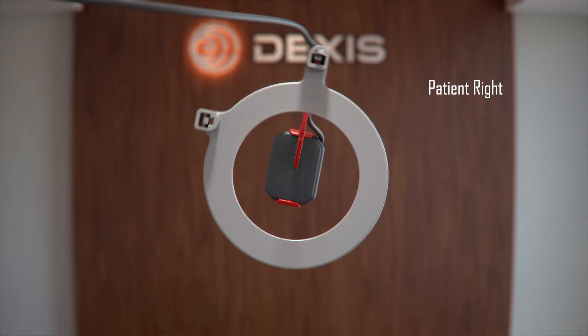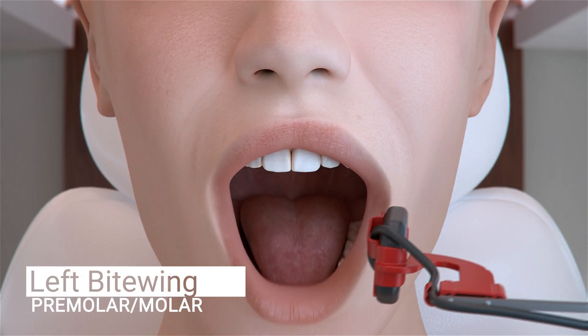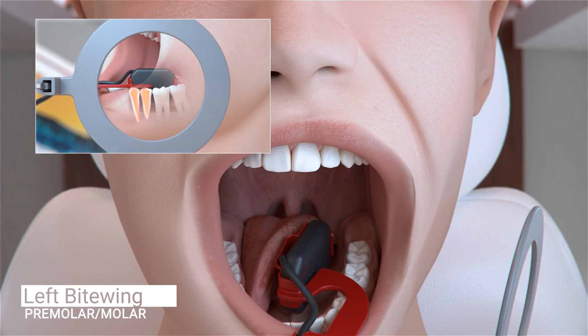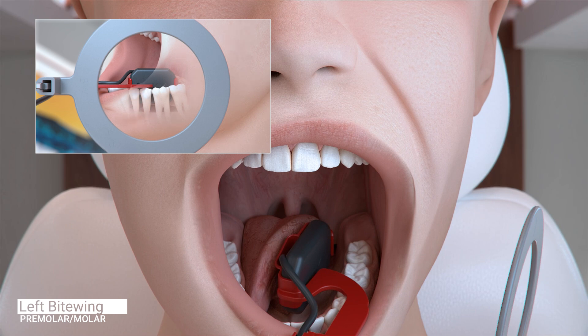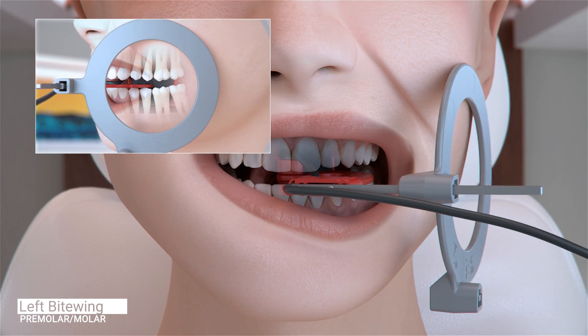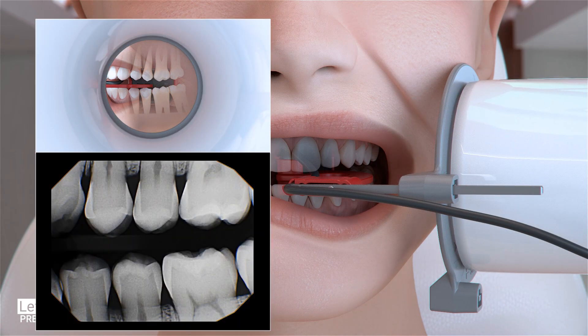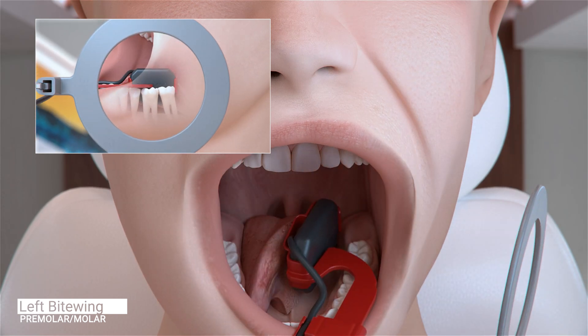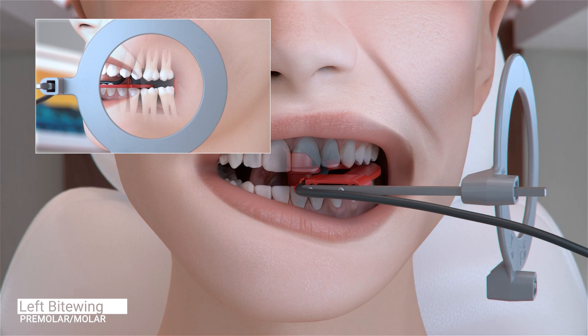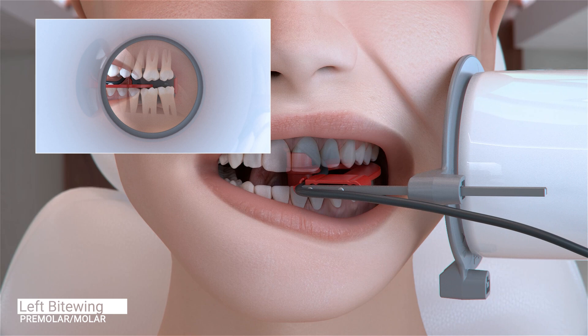The configuration of the sensor and holder does not change for the next and final set of images, the left bite wings. Ask the patient to open slightly and center the first and second premolar on the sensor. Move the sensor toward the midline and slightly forward again to capture the distal of the canine and ask the patient to close. Slide the aiming ring close to the patient's face, position the x-ray emitter cone flush with the aiming ring and trigger the exposure. Position the sensor so it is parallel to the occlusal line, center the sensor on the second molar and ask the patient to close. Slide the aiming ring close to the patient's face, position the x-ray emitter cone flush with the aiming ring and trigger the exposure.